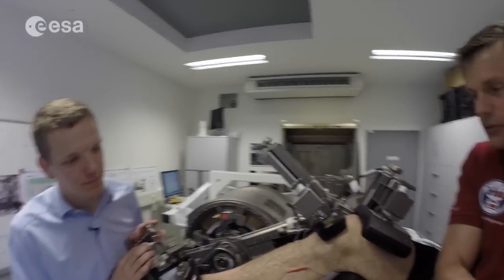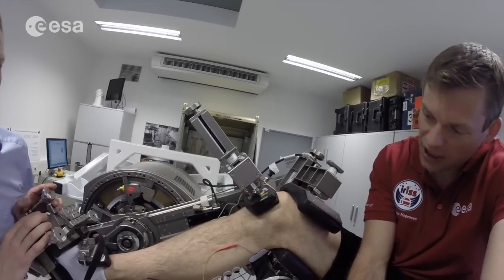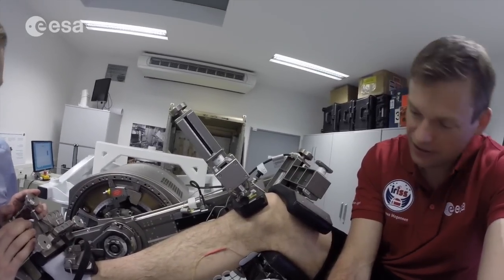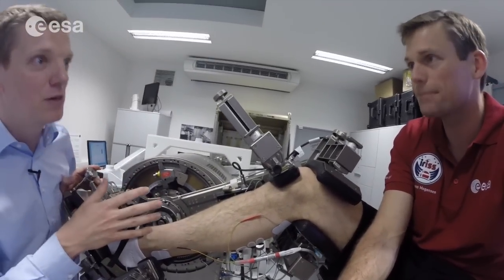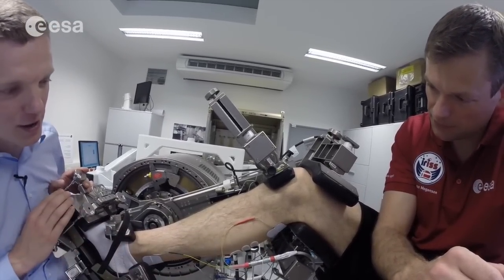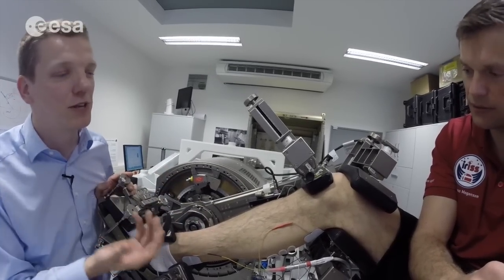We'll be able to distinguish between them by me doing exercises on this and recording the torque values, and then at the same time applying electrical stimulation to see if the muscle is capable of more than I'm actually asking of it. That's perfectly summarized. It's important to distinguish what your muscle is capable of and what your brain is capable of asking of your muscle. Using stimulation electrodes along your muscle, we can apply a known standard level of stimulation independently from your control or from your muscle, and we see the resulting force.